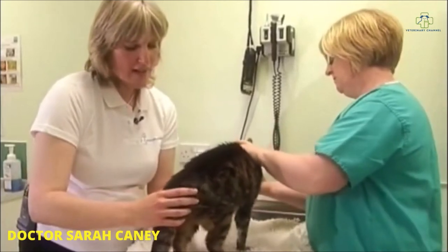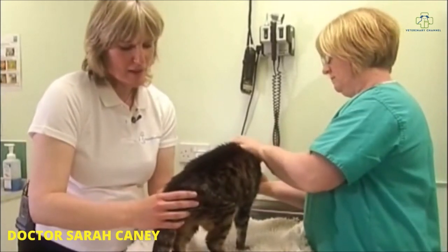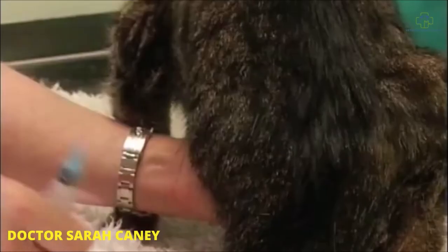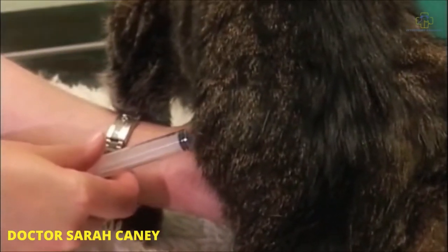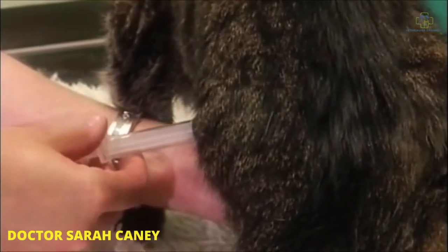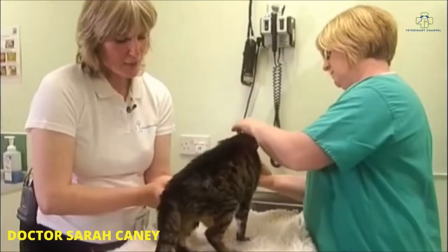I stabilize the bladder, and once I'm happy it's stabilized, I can then introduce the needle over the skin, slide it in very gently, and then collect a sample.